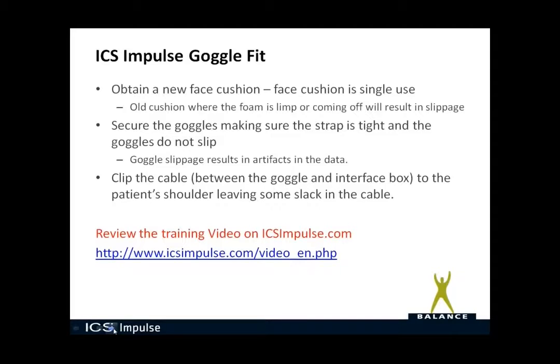Again, this is just reiterating some things that I saw people were not performing even after viewing the training video, but these are important aspects of performing a good head impulse test. Again, you can view the full training video on ICSimpulse.com. One other thing regarding the training video on ICSimpulse.com, this training video is available in English and German, and it's subtitled in French, Spanish, and Italian.